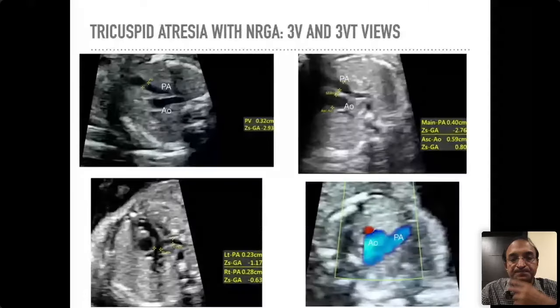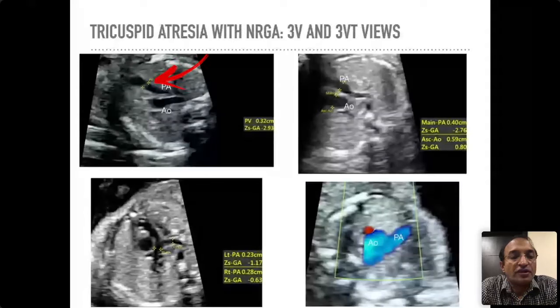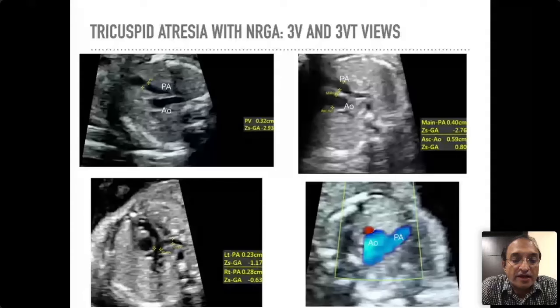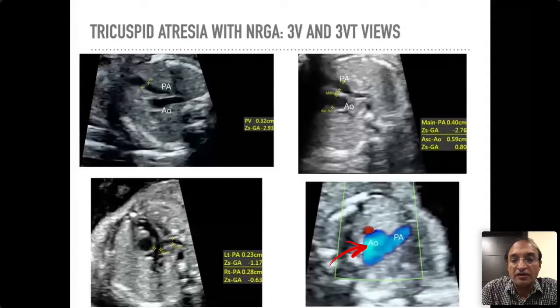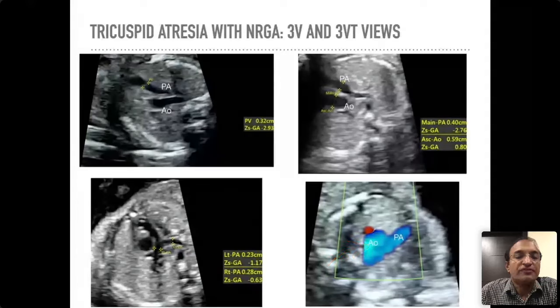Let us see examples of both. This is tricuspid atresia with normally related great arteries — I am showing the three-vessel view. You can see that the PA in comparison to the aorta is definitely smaller, the two branch pulmonary arteries are also smaller, and in the bottom right you can see the three-vessel tracheal view with color. The aorta is big while the PA is smaller, obviously suggesting pulmonary stenosis.